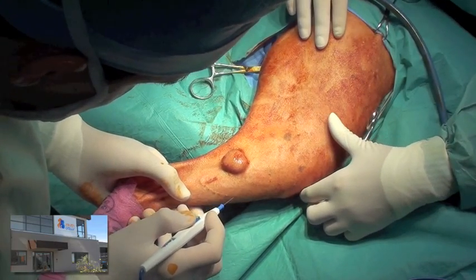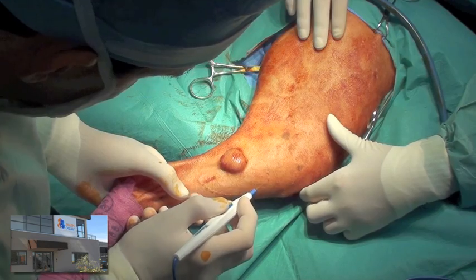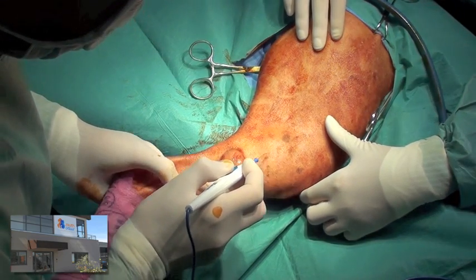The proposed surgical margin at three centimeters away from the primary tumor is marked using electrocautery.